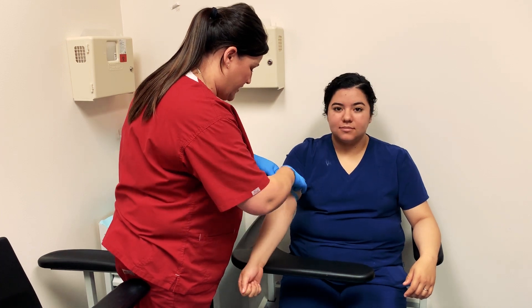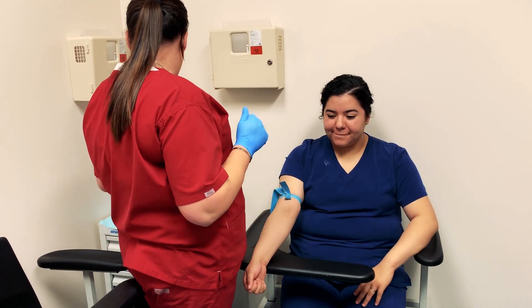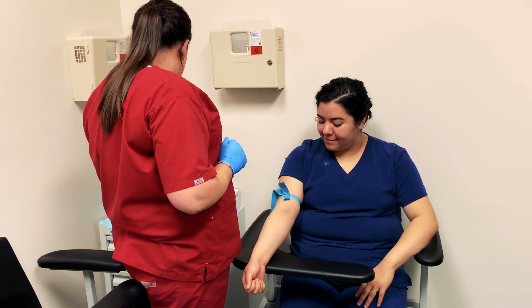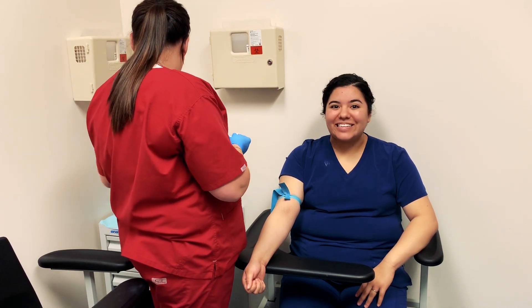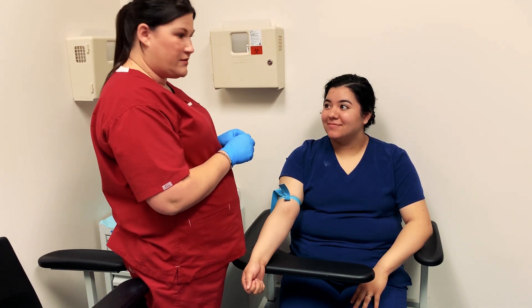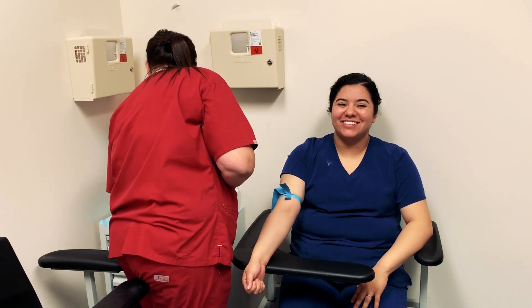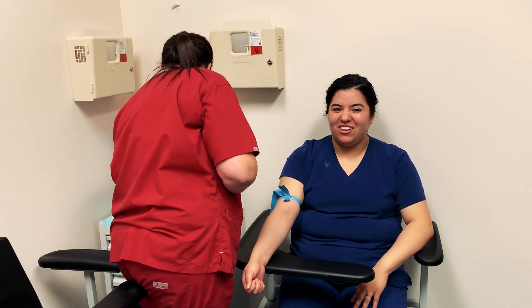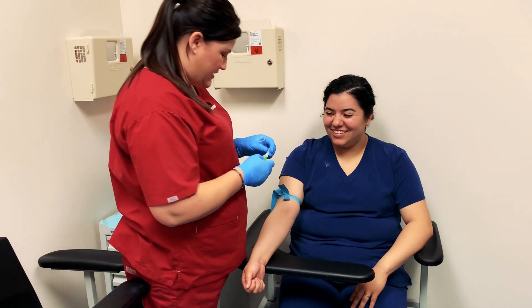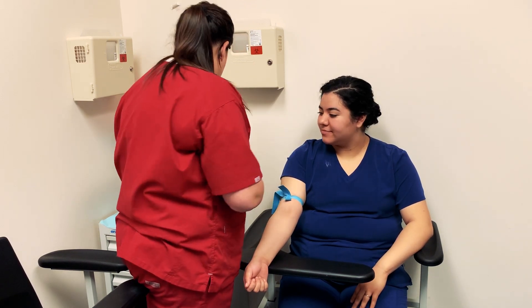Hey guys, so I'm going to collect a specimen really quickly and then I'm going to prepare it for transport to the lab. My patient Eliana here is gracious enough to let me draw her blood — I may or may not have coerced her into that. I'm going to assemble my equipment and do a quick lab draw.